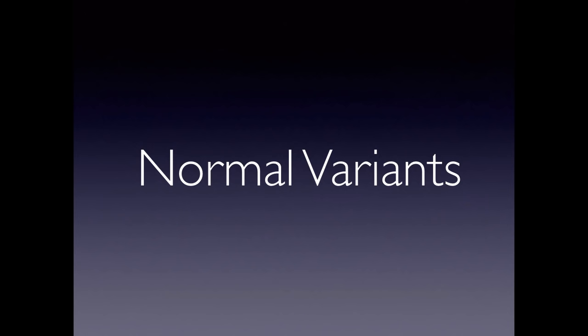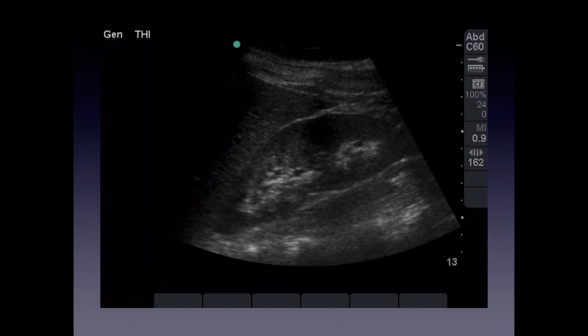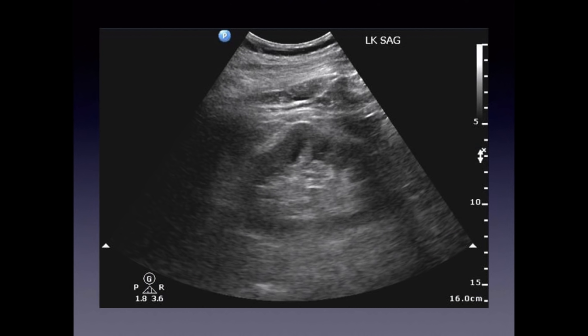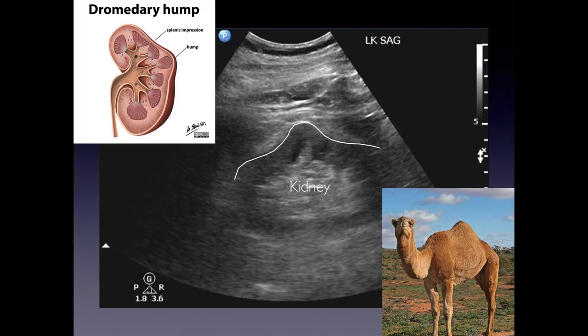A couple of normal variants to be aware of: a dual collecting system looks like there's a break or space in the renal sinus, and you'll occasionally see this. Another variant is the dromedary hump — named after the camel — seen on the left kidney where the contour rises up like a hump. This is related to the kidney fitting up against the spleen on the left side and is entirely normal.